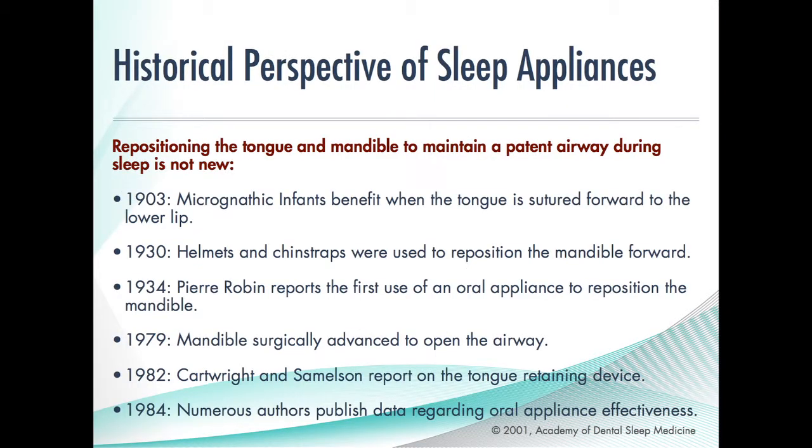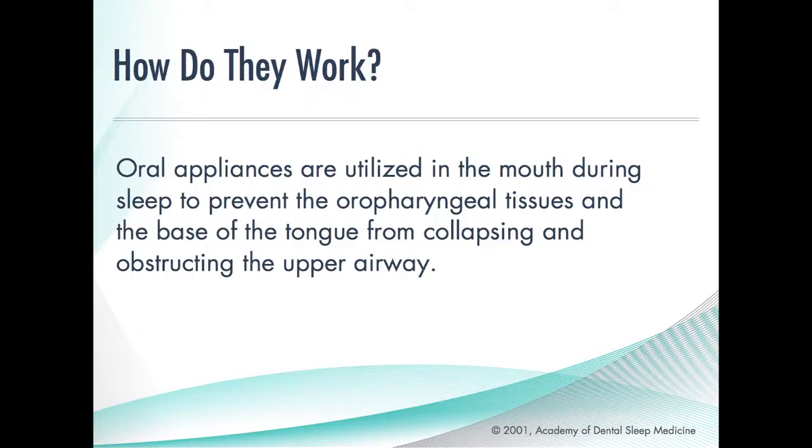So historical perspective, it's been around. We've known about this stuff for a long time. This isn't like new to us. But in terms of the oral appliances, it really came about 15 years ago. And this has created a little bit of an issue for me because I signed a lot of contracts with all these medical groups to handle their TMD patients, and sleep didn't exist, at least the sleep appliances. The cone beam technology from even 5 years ago is just like fuzzography. It's worthless. So we've known about it, but the technology didn't exist, and so it's a baby science. So we're learning.